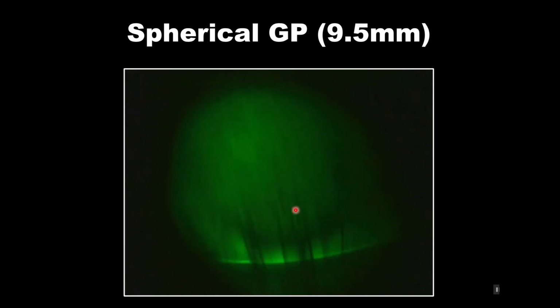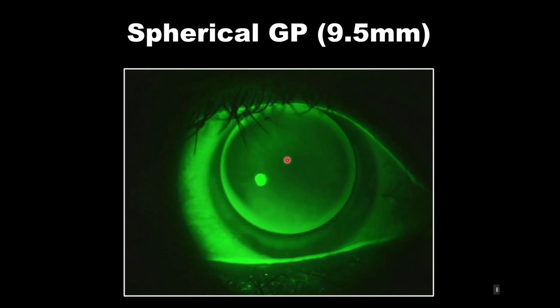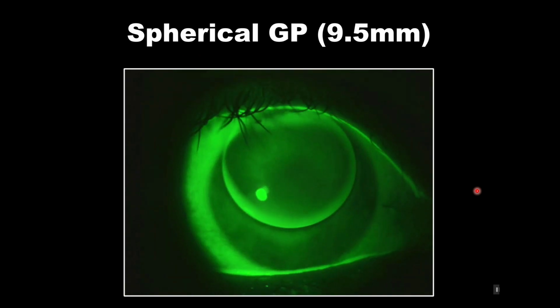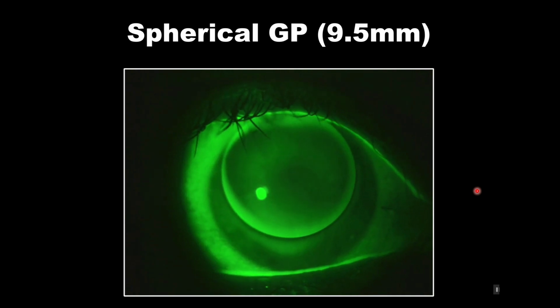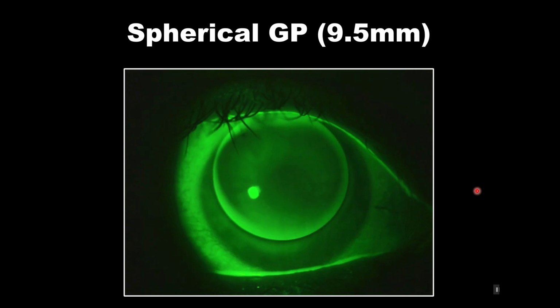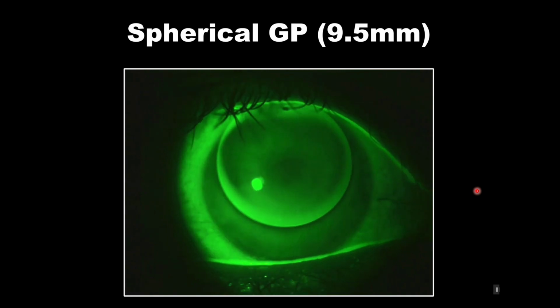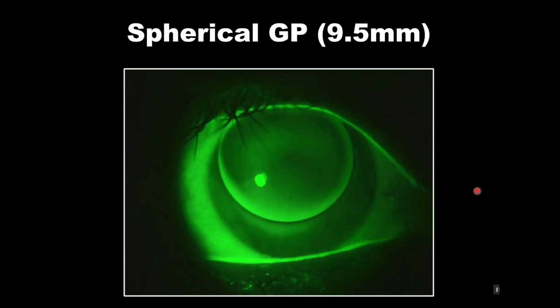So if we were to place that lens on eye, you see a good relationship of this fit across the flat meridian, but in the steep meridian, the vertical, we see that lens with an inadequate relationship. The lens is tilting against the superior cornea with the lid force. It's not incredibly stable. It's not incredibly well centered. We lack a decent alignment in that vertical meridian.